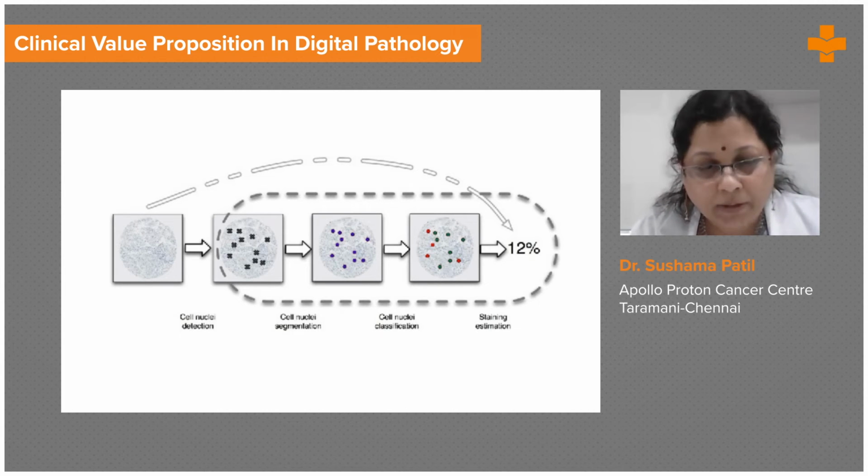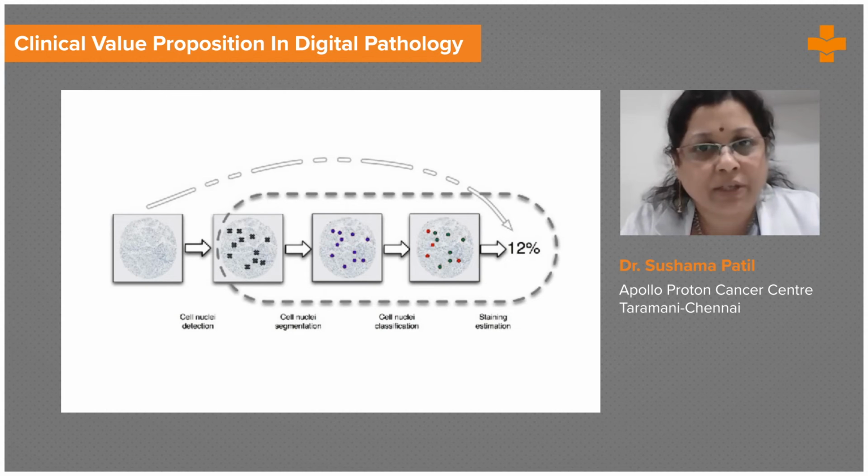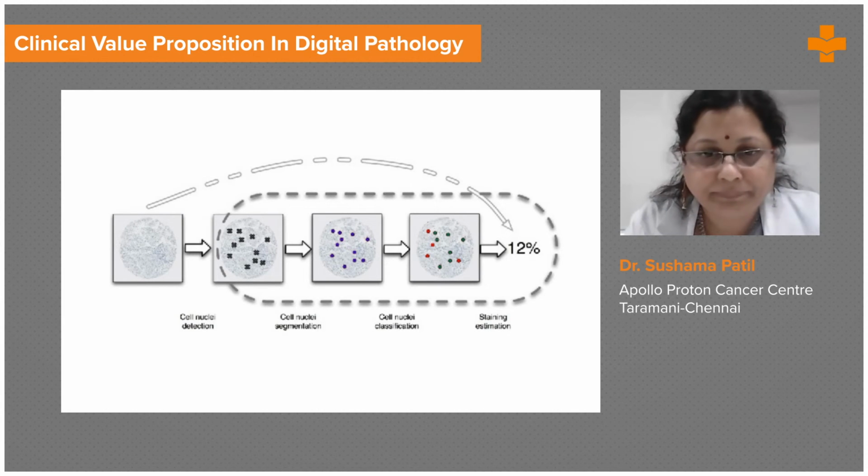So the heart and the core of computational analysis is the presence of digital libraries of pathology images. So we at Apollo Hospitals are very well poised to do this, because we have a very vast network of hospitals that are now going to be in one chain, and a common image data archive can be created, which can be used for computational activities.